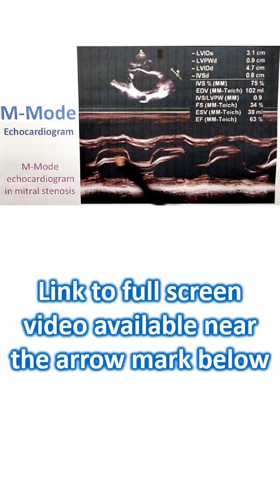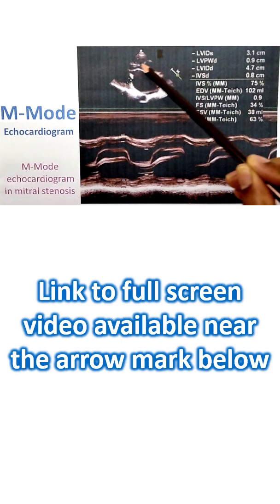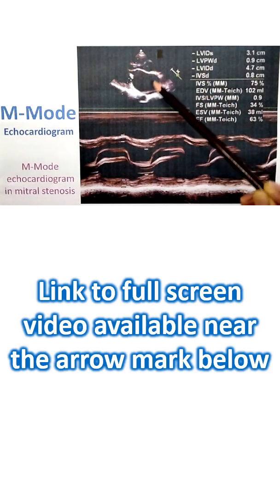This is the mitral valve echocardiogram. This particular M-mode echocardiogram is from a case of mitral stenosis. You can see the calcification of the tip of the posterior mitral leaflet here and doming of the anterior mitral leaflet. You can also call it as a hockey stick appearance. And you can see that the left atrium is grossly dilated.